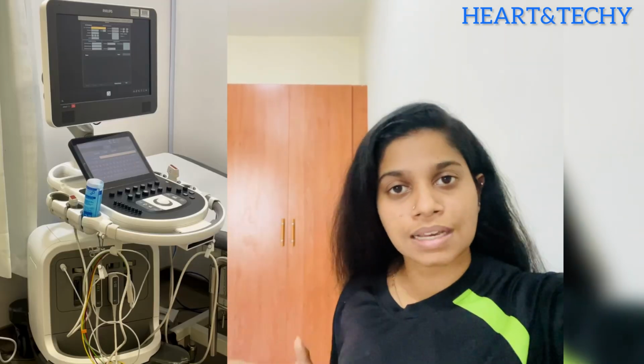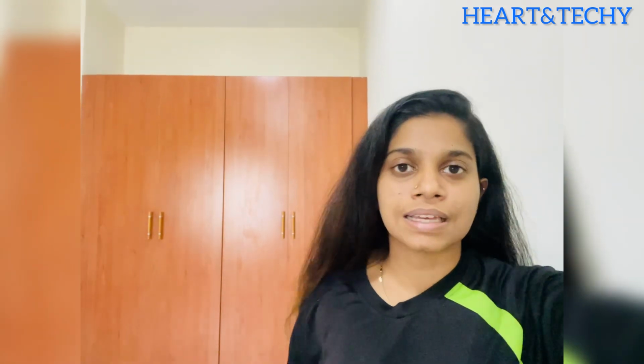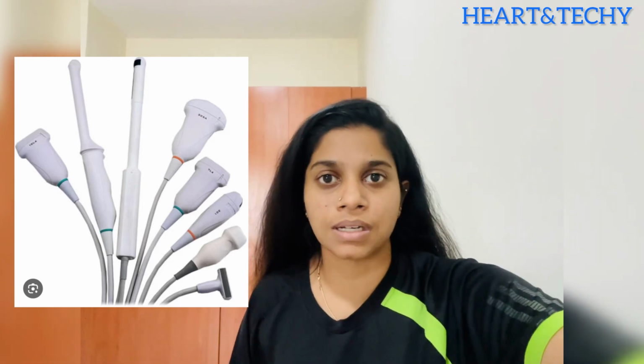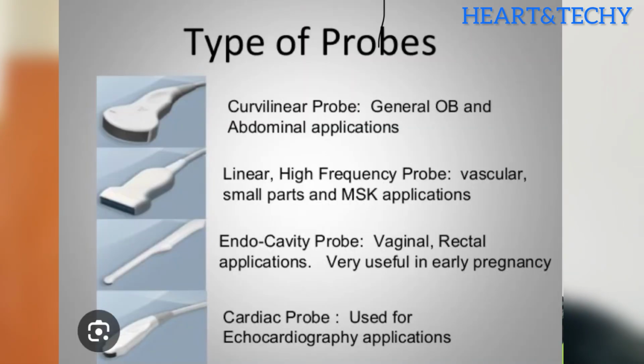So this is an ultrasound equipment. Whether we are doing a cardiac scan or an ultrasound scan, all the things we do are basic, and the only difference is that for each organ we use different types of probes, which I'll explain in the upcoming sections.